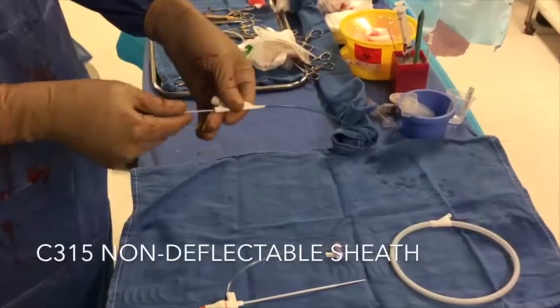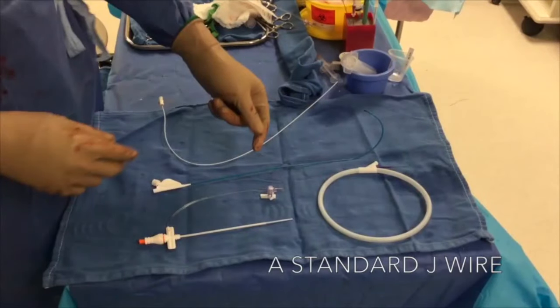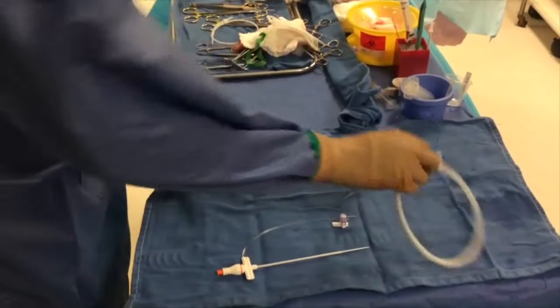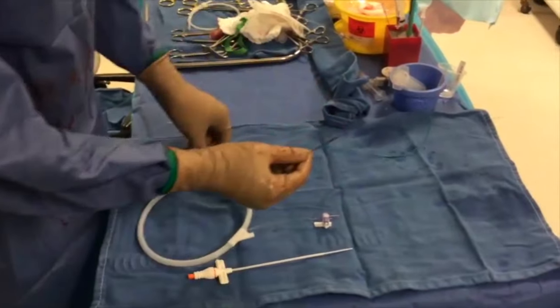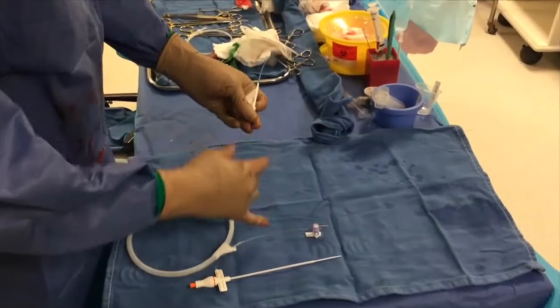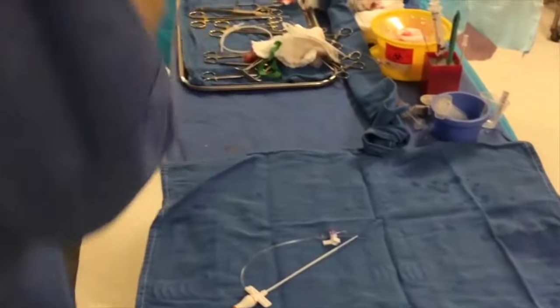The entire apparatus can be preloaded outside the body with the J-wire placed at the distal tip. This makes it easier to place the entire apparatus within the 7-French short sheath into the right atrium or right ventricle. The dilator, sheath, and the guide wire are all advanced together through the 7-French sheath. The guide wire is then placed either in the right atrium or into the right ventricle, and the entire sheath and the dilator are advanced into the right atrium.